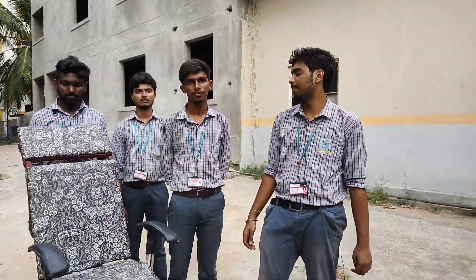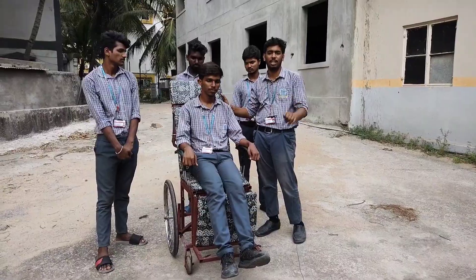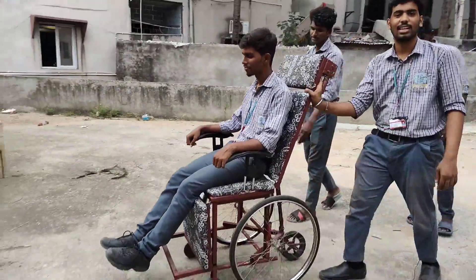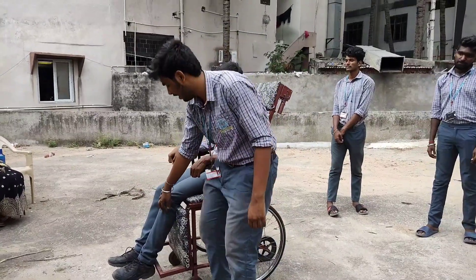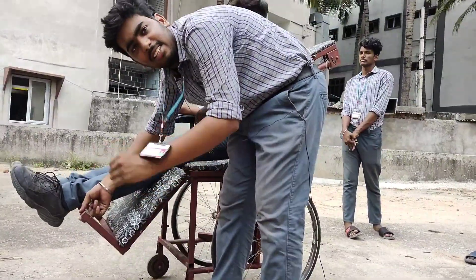Coming to the working of our project — when the patient wants to move from one place to another, we can use this wheelchair for easy and comfortable transport. When the patient wants to rest his legs at any comfort position, he can lift and adjust the lever so that he can rest completely with easy comfort.